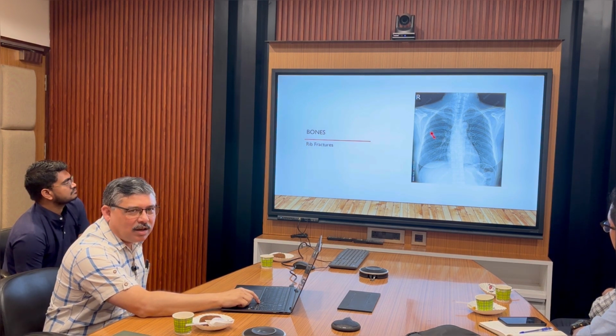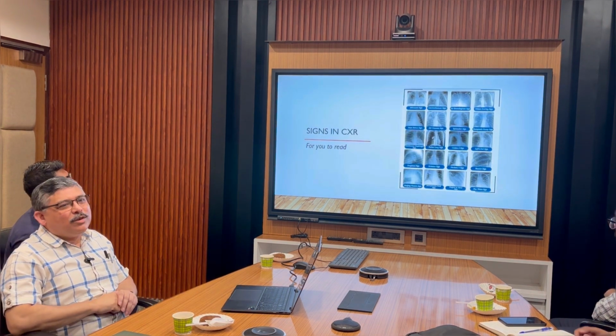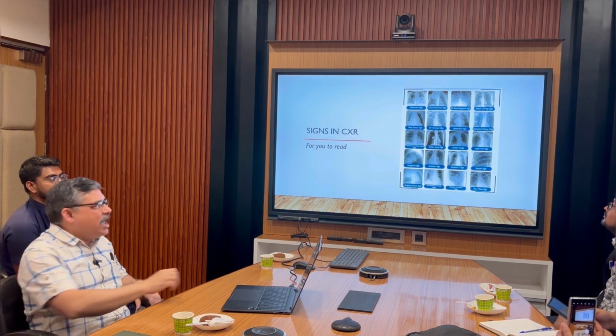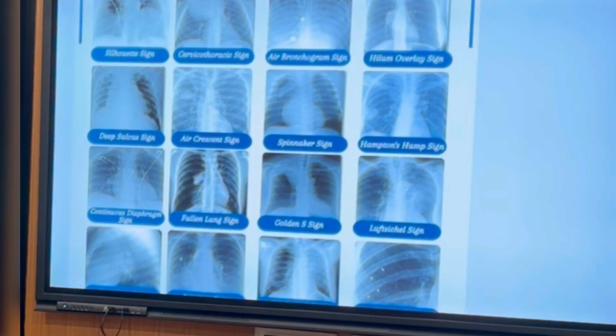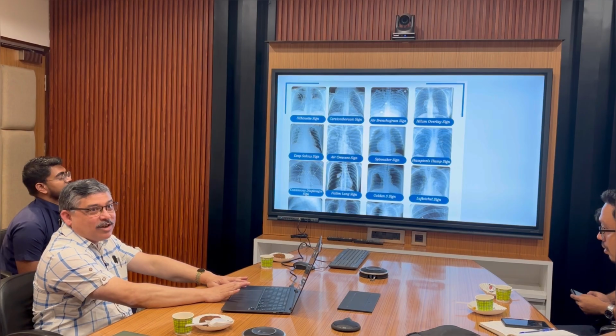Was it interesting? Yes. So this is for you to read. There are so many signs. Silhouette signs, cervicothoracic signs, there are so many. I hardly know a few of them. Hampton's hump, you must have got it in MCQs.